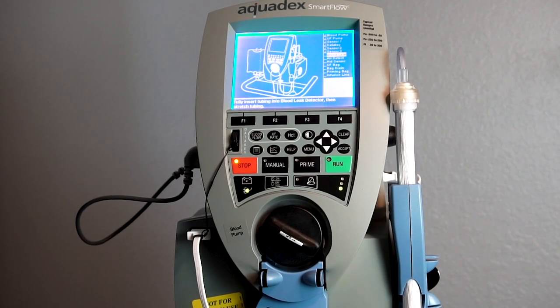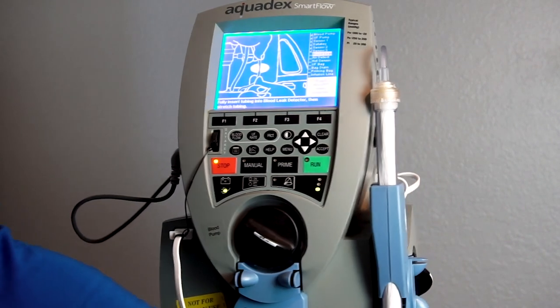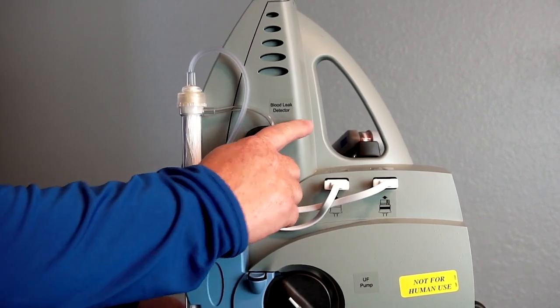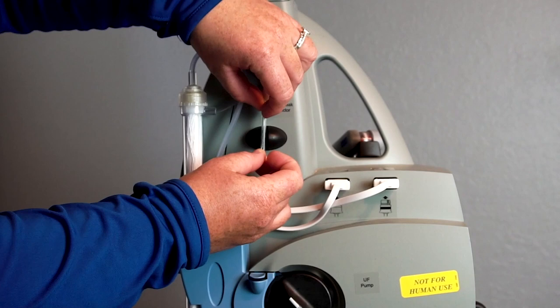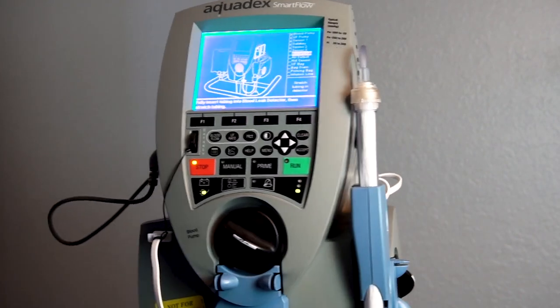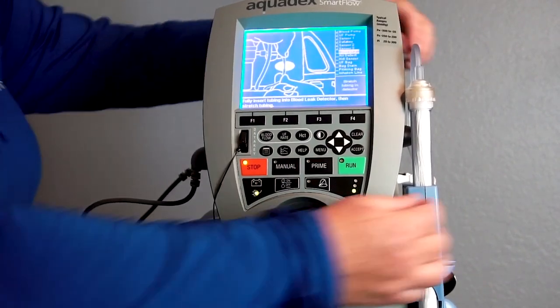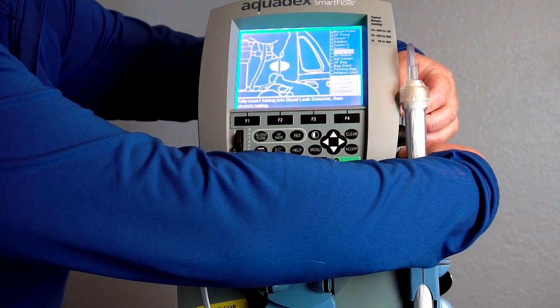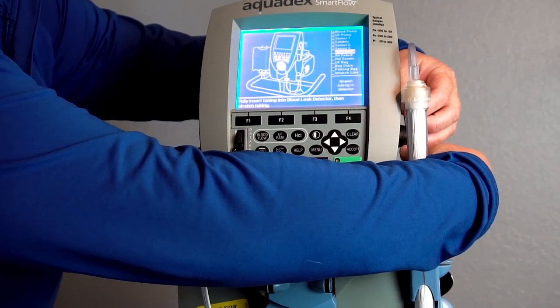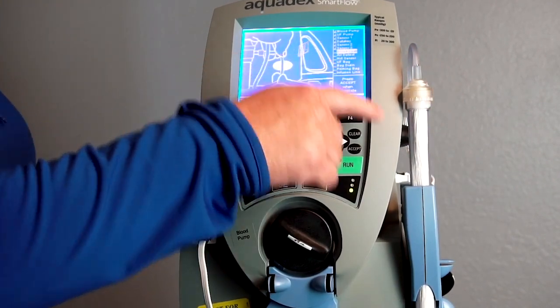Next, you'll insert the tubing into the blood leak detector. Turn the console to its side and locate the blood leak detector, which is labeled. Pull the tubing so that it is taut as you place it into the detector. A prompt will tell you to stretch the tubing in the detector — pull from both sides to stretch it and then ensure that it's fully seated. Press accept when complete.